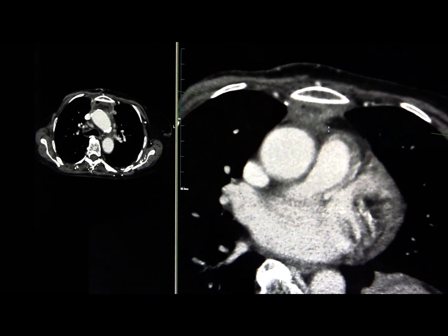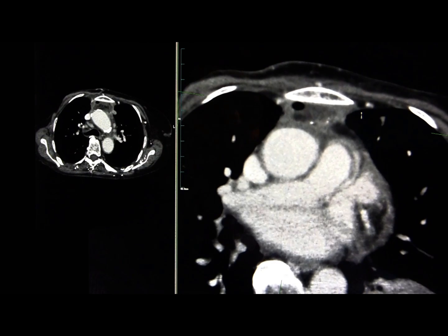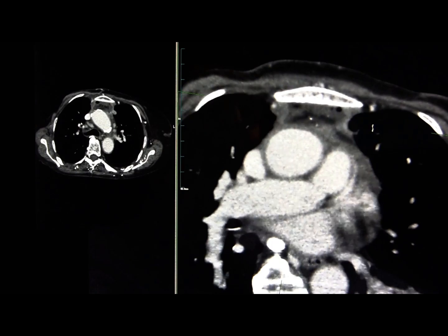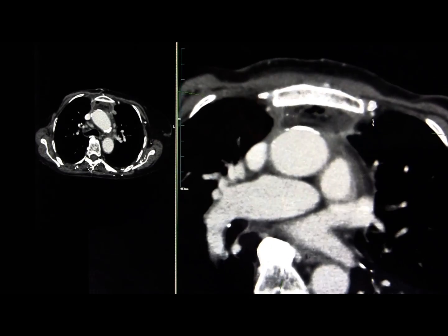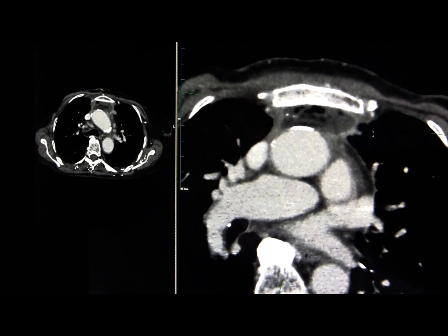The plan today, therefore, is to see if we can put just one of our standard 8 French drains into this space in here. What I'm proposing to do is to come in from an oblique approach. We've got the internal mammary artery and vein here, which obviously we need to avoid. We'll be able to see those under Fluoro CT. I'll angle up from below, so a steep angling up approach from below, oblique, come in just behind the sternum there, and then pop the wire into that space. And then run a couple of dilators and then park a little 8 French self-retaining drain just in here.